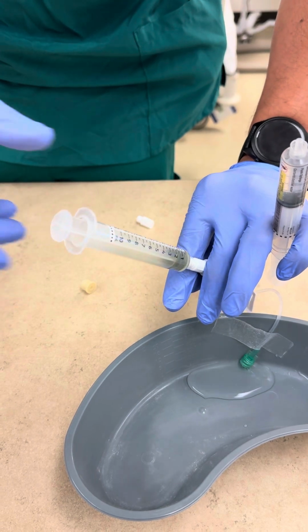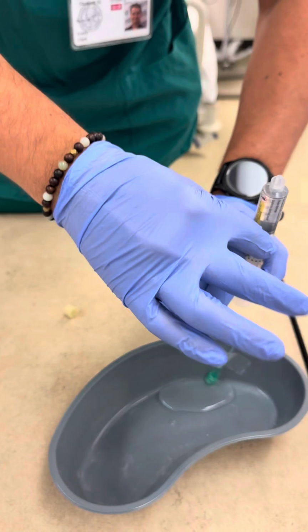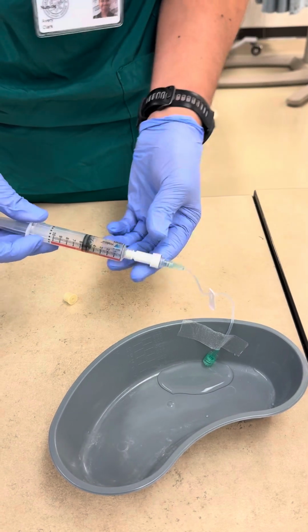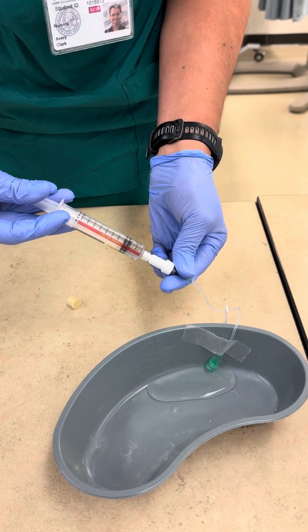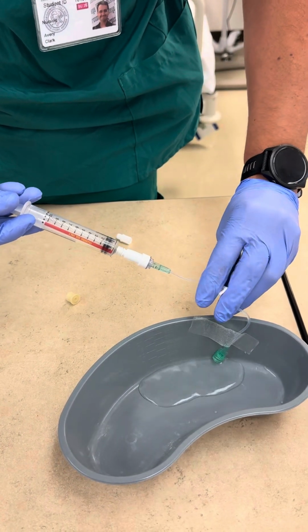Once that 30 seconds is complete, I'm going to remove the medication and place it to the side and take the remaining amount of saline. And I've completely waited the 30 seconds, so now I can administer the rest of the flush. And then at the very end, I'm going to ensure that it's saline locked.